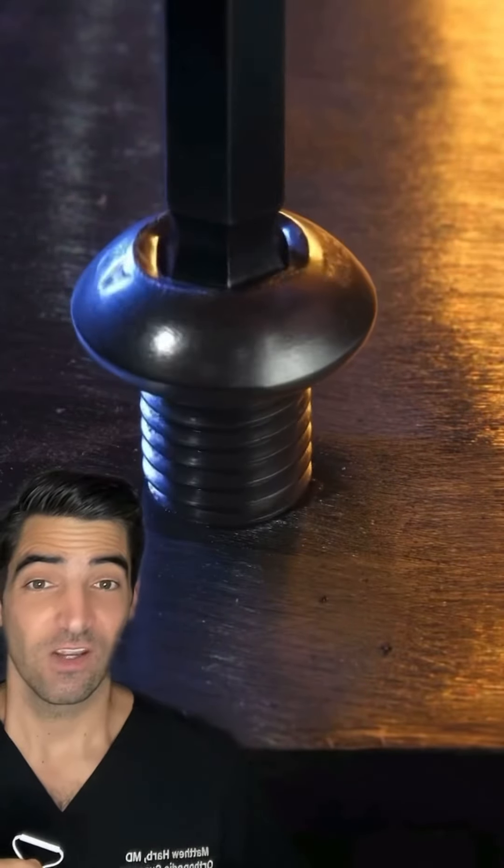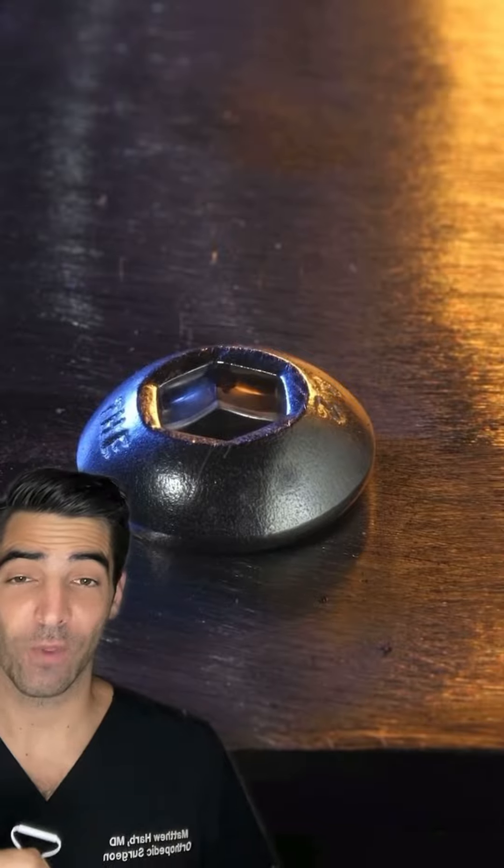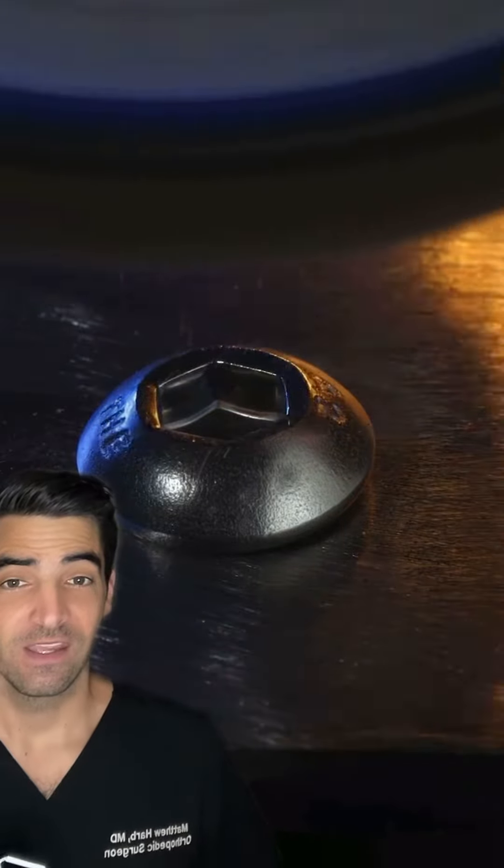As an orthopedic surgeon, we're putting metal and screws and plates into the human body all the time. So if you're putting those things in, you need to know how to take them out.